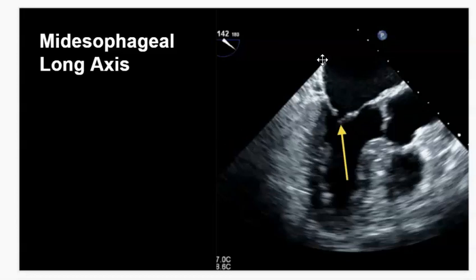We're going to go over a little bit the cut planes of this when I show you a video of this. The cut planes in transesophageal are different than the cut planes that we see in transthoracic. Because of where the probe is and how it's cutting through the heart, these structures aren't the same. They're actually kind of reversed from what we see in transthoracic.